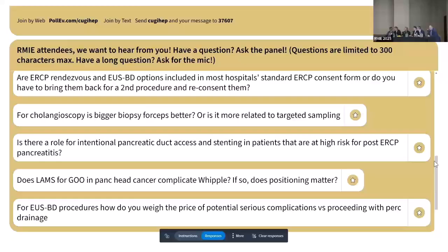It's probably different. Yeah, I'm going to quote Ryan quoting the Greek philosopher about the river never being the same for two different men. In the same way, I don't think two papillas are the same, and I don't think two endoscopists are the same. So if I use pure wire cannulation predominantly, and if I just use a wire and it flies into the pancreatic duct, I will be more likely to do what Colin said and pull that wire back and try to redirect. Whereas if the papilla is tiny, it's inside a diverticulum, I've been trying to even just get my tome to the papilla for 20 minutes, and I finally get a wire in, it's in the PD, I'm going to take that wire and I'm going to do double wire at that point. So I think it really depends.